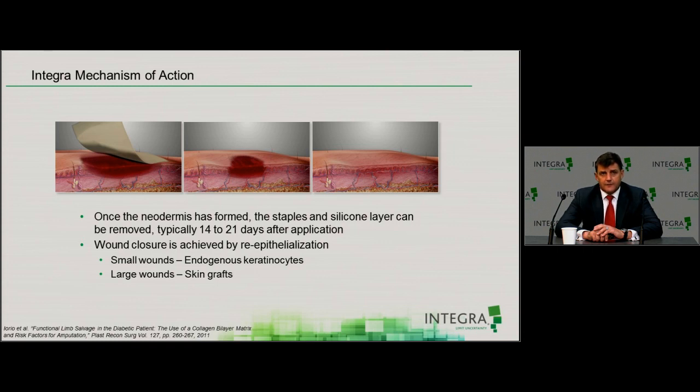Here also in cartoon form, you'll see this neodermis being formed. It looks in this cartoon somewhat like underneath, but it's really in conjunction with the IDRT therapy. You think of this as a paste filling the wound that allows for the influx, and really, as I explained to my residents and students, almost as the building contractor telling the trucks where to back up and put the important parts in to help build the structure, the superstructure of the skin that allows us to go on and then close the wound.